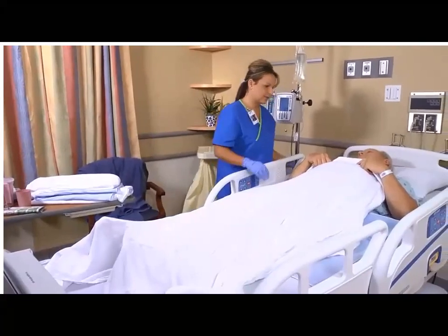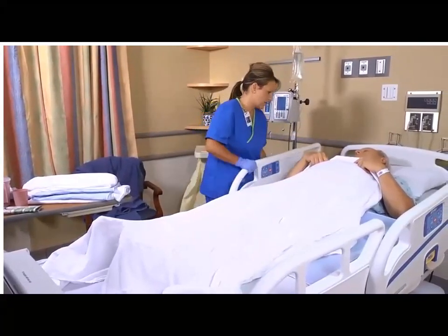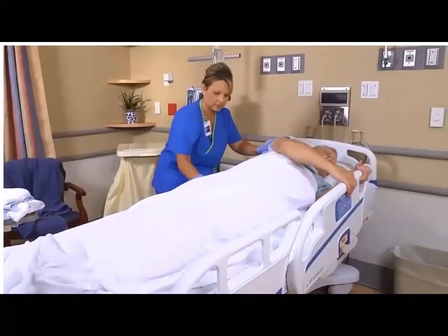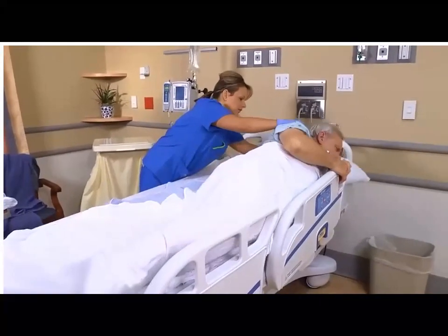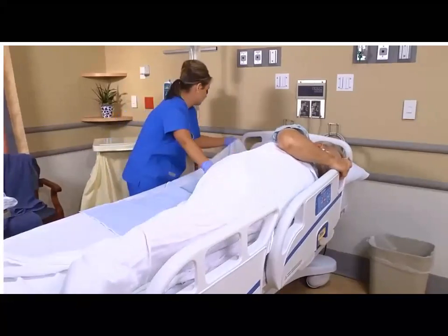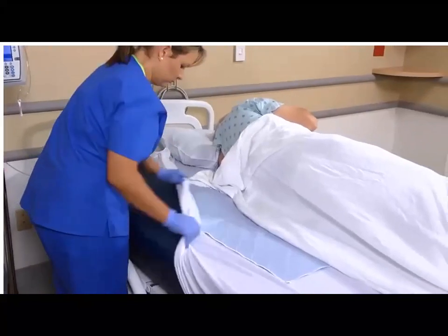Lower the rail on your side of the bed. Help the patient into a side-lying position, facing away from you. Encourage him to use the side rail to turn. Then adjust the pillow beneath his head. Make sure no tension has been placed on any external medical devices, such as indwelling catheters, wound drains, and IV tubing.